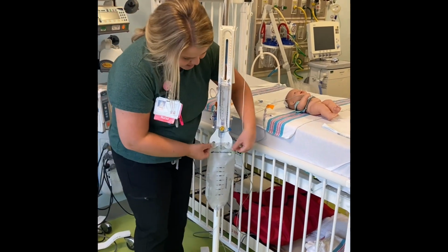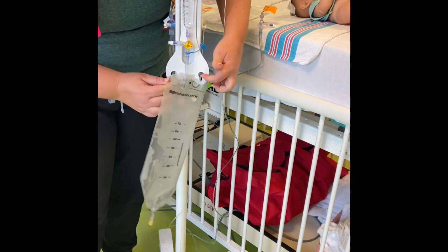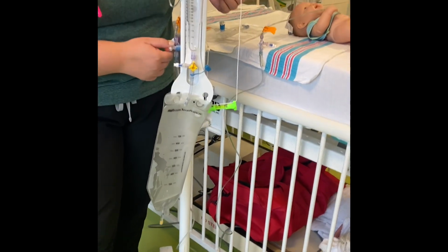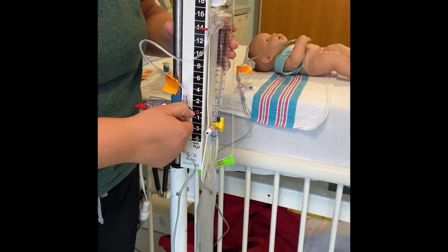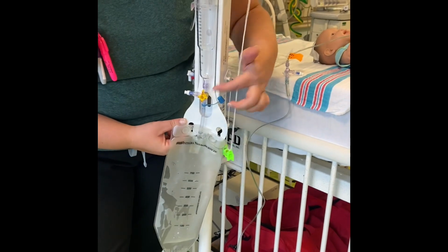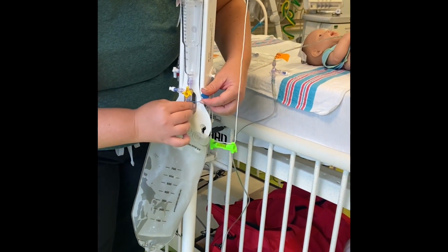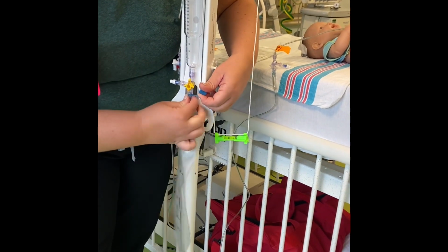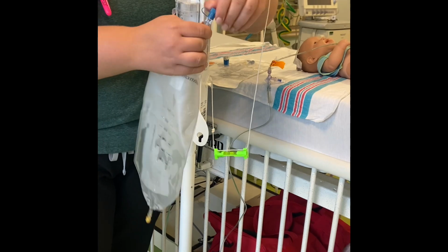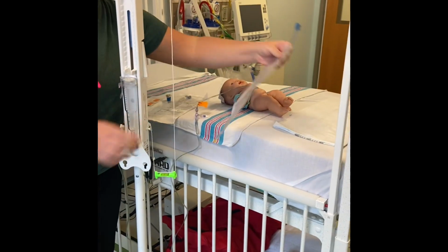So what you're going to do next is you're going to pop these little circles off the sides here. You're going to make sure that your patient is clamped. So we're going to take this, turn it off to the patient, and we're going to leave this one clamped to the buretrol here. You're then going to twist here at the top, take your cap, and put your cap on. This can now sit off to the side.